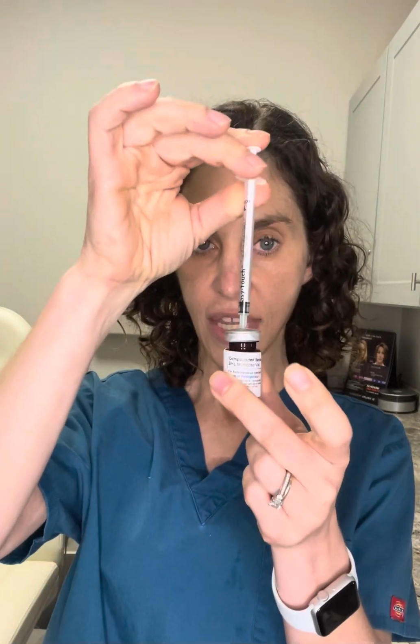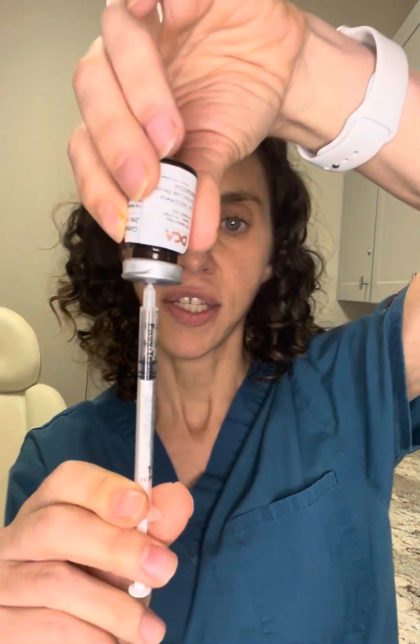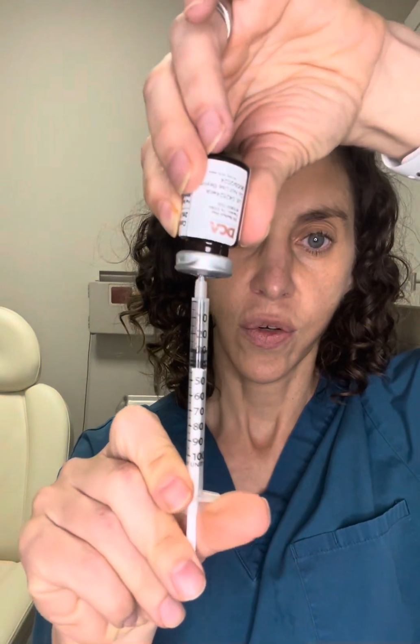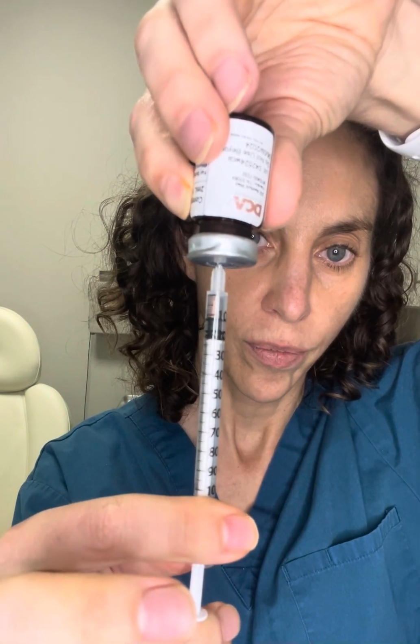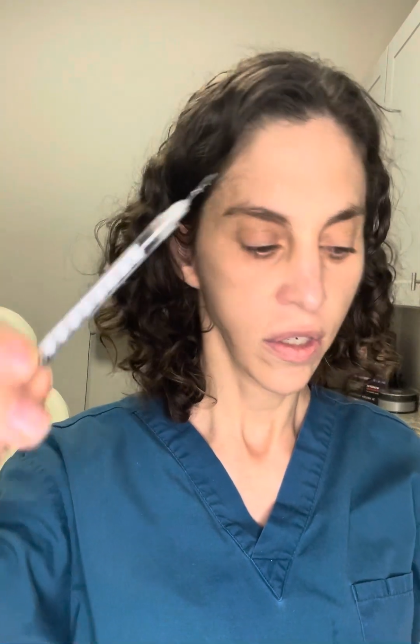Then with the needle in the vial, you flip it over and then you pull back on the syringe. This just allows for the medication to move more freely. You will see that there's far more in the syringe than what we actually need. Let's say that you need 10 units. So then what we will do is we will push the plunger back up to 10. And then we take it out. Here you see we are at 10 units.